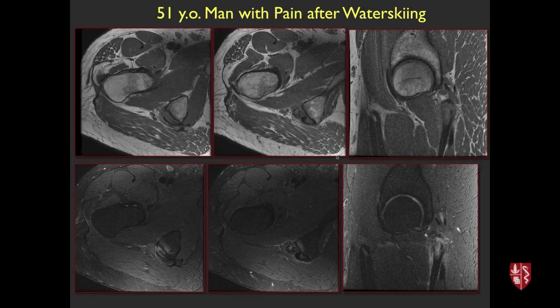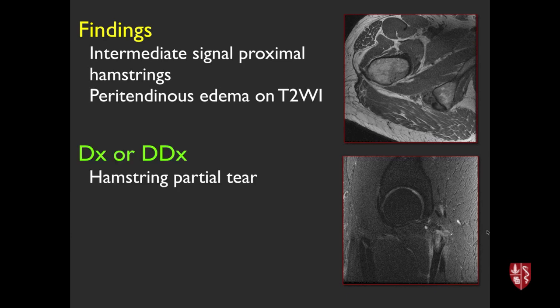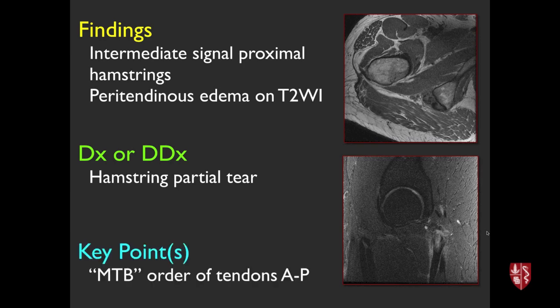51-year-old man with pain after water skiing. MRI shows intermediate signal and edema in the proximal hamstrings — they should be uniformly dark. This is a partial tear of the proximal hamstrings. The order of the tendons can be remembered as MTB: semimembranosus, semitendinosus, and biceps. This case appears to involve more of the semimembranosus component.